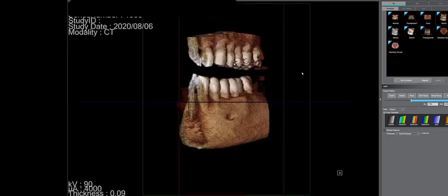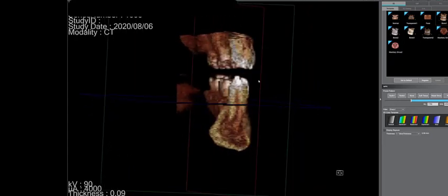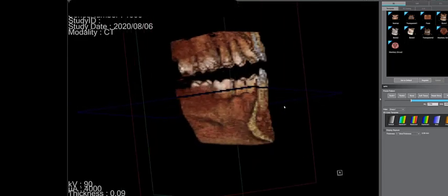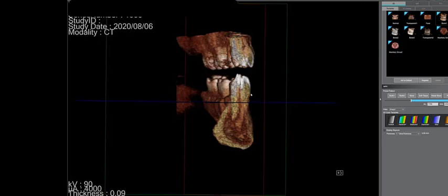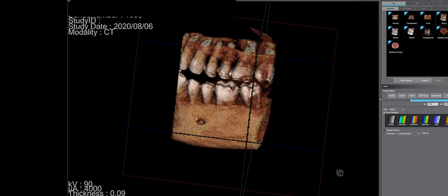Right. Yeah. Really what you're getting at is trust. The patient thinks, can I trust what this person's telling me? So I find that the best image for that is the three-dimensional rendering. Because the other ones don't make a lot of sense to patients. But when you show them the three-dimensional rendering, and you can say, hey, this is exactly what you look like without skin, and I can tell you with certainty that there's a nerve right there. And we're taking this tooth out, and I know exactly where that nerve is in relation to those tooth roots. You can give them that level of detail.